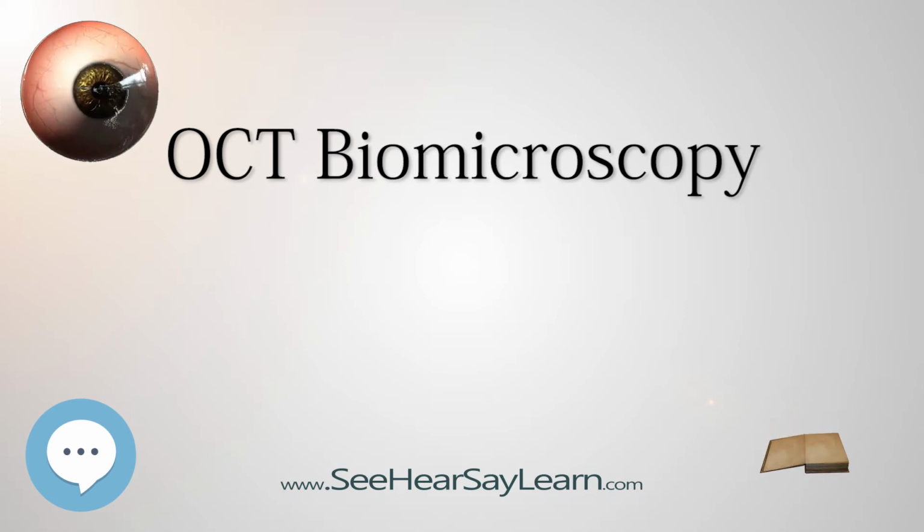Findings from slit-lamp examinations are generally considered to be subjective and qualitative. For example, one ophthalmologist may rate a patient's anterior chamber reaction as 1+ cell with trace flare, while a specialist might rate the same patient's anterior chamber reaction as 2+ cell with 2+ flare. Without any objective documentation of the examination findings from that specific visit, it can be difficult to determine in retrospect which assessment was correct.